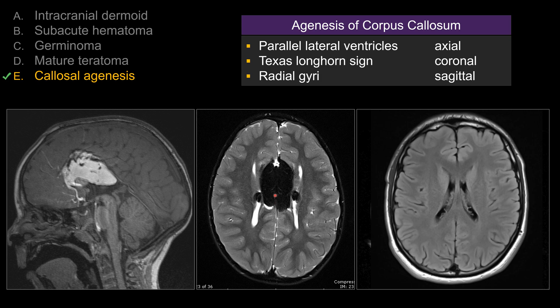On the sagittal view, you have this radial appearance of the gyri due to absence of the corpus callosum, as well as absence of the cingulate gyrus.